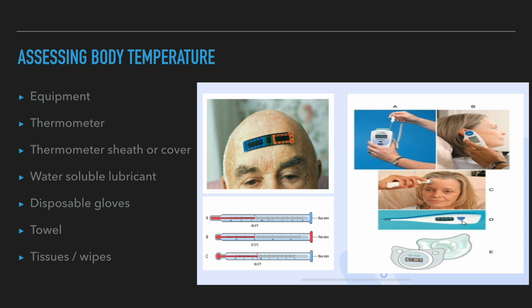The thermometer displays results based on the Celsius or Fahrenheit scale. Some thermometers can display readings from both scales. The electronic thermometer is ideally suited for use with children because the sheath is unbreakable and the time necessary for accurate measurement is relatively short. A separate probe can be used for rectal temperature measurement.